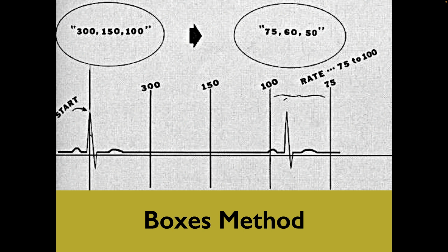So here's how you do the boxes method. Here we have the large boxes, these lines here, and here we have our ECG complexes. Here's one, here's another. Everybody following that?